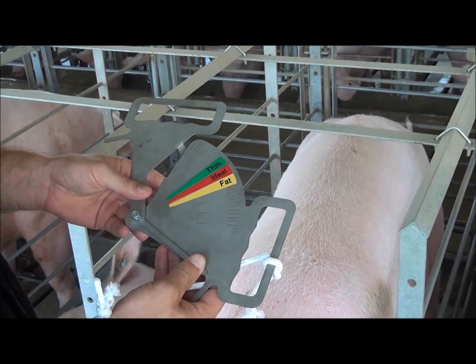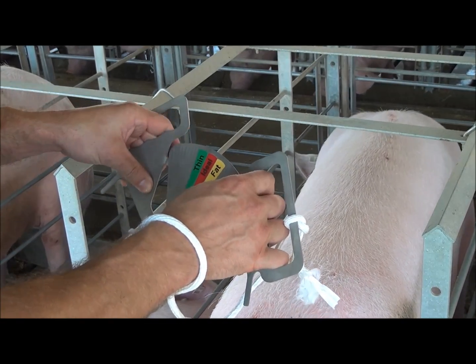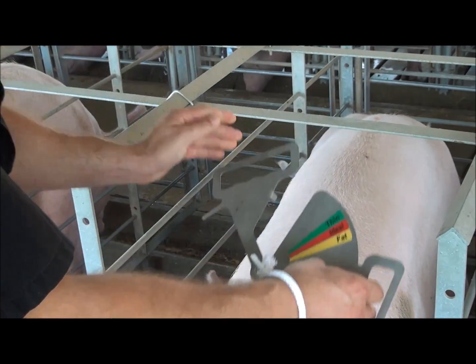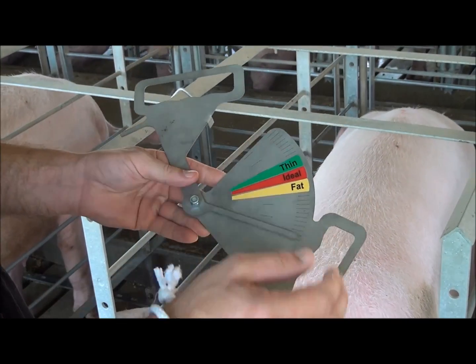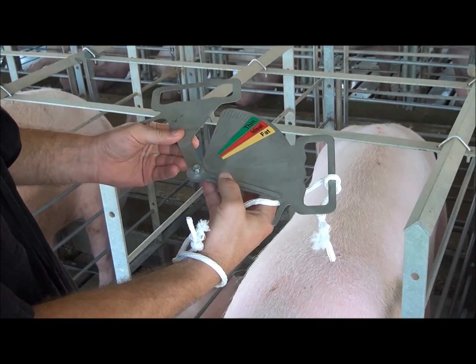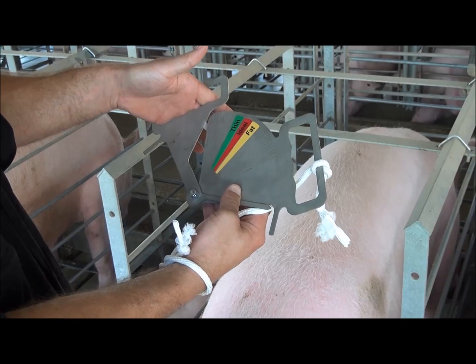The first safety feature we have is the handles, as you can see here. They're designed so you can place your fingers inside, so when you're measuring a sow and if she moves, you don't get your fingers caught between the sow and the metal. The other safety feature on the caliper is the little stopper, as you can see right here, so the caliper only goes to that point to keep it safe for your finger.